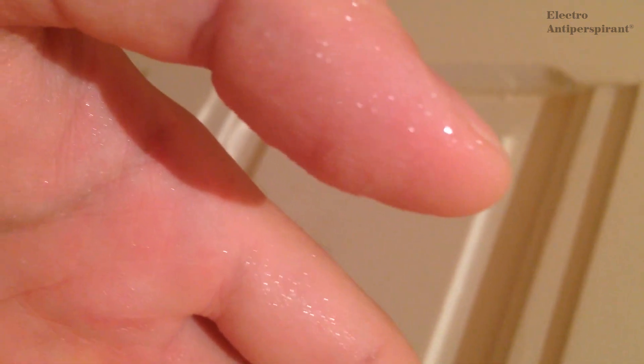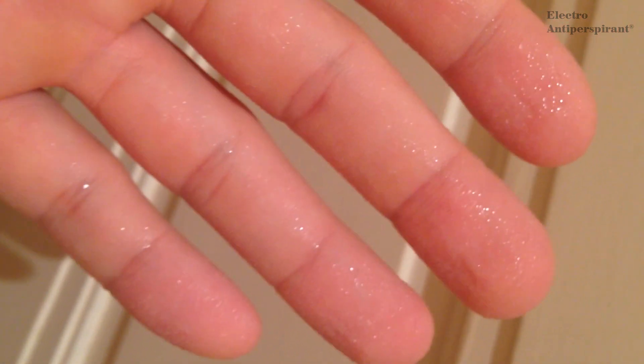This is my hyperhidrosis of palms and fingers. I bought an electroantiperspirant and now I want to try its efficiency and effectiveness.